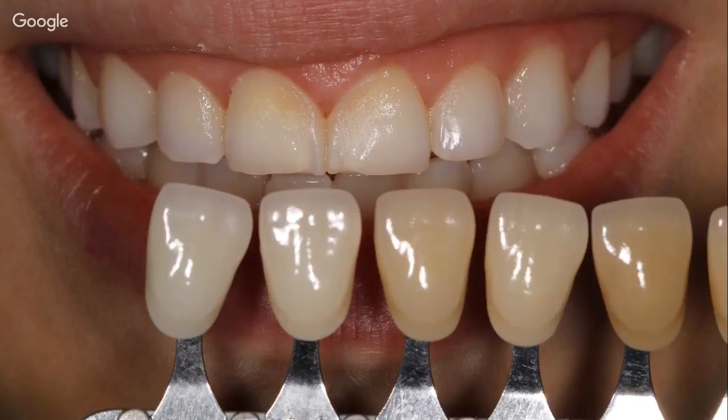Now, why composite? The reason is that I don't want to prep the teeth. I don't want to remove undercuts. I don't want to create a really well-defined finish line everywhere for my lab technician. I want it to be as conservative as possible, and this is where the composite shines.